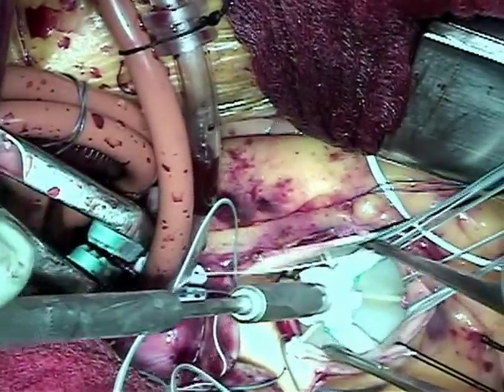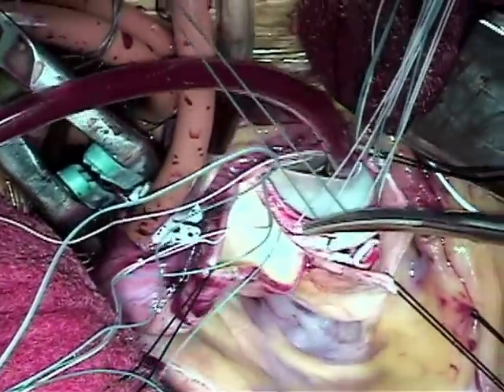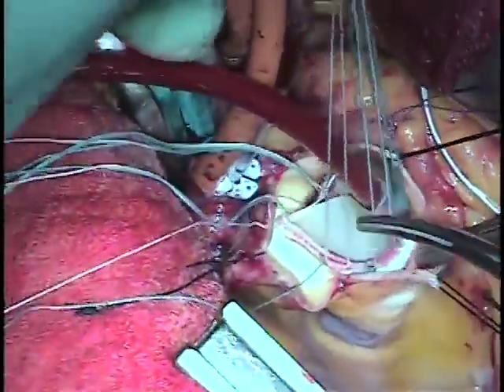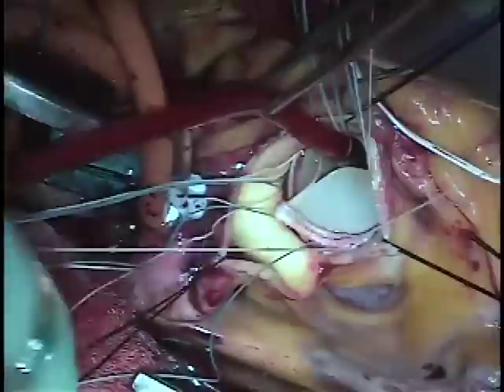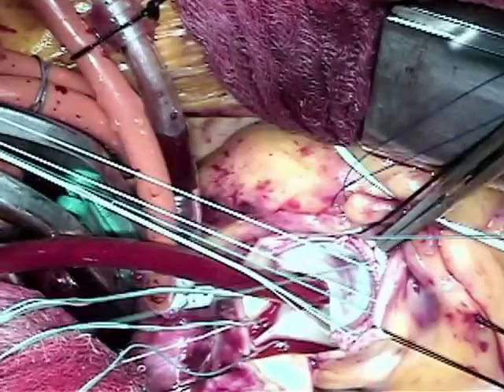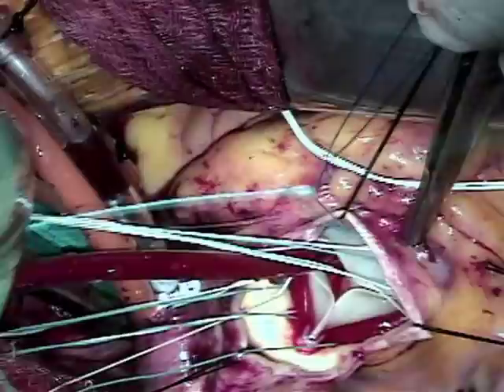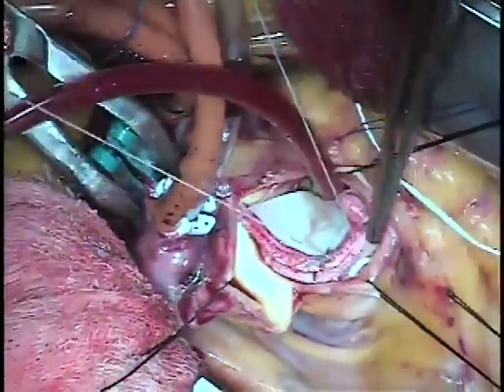Once it's seated we tie it into position, and there you see the annular pledges on top of the annulus and the valve being tightened into position. The valve takes a bit longer to put in because the annulus of the new valve is not quite as big as the older one. We go around and tie down all those sutures, making sure that the valve is snug, that there are no gaps, and the pledges are pulled down around the native annulus.